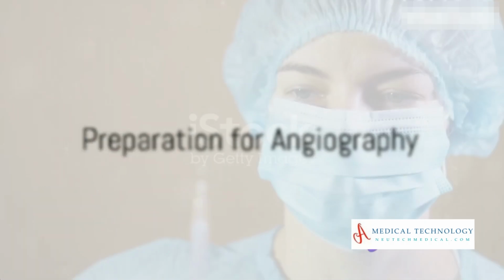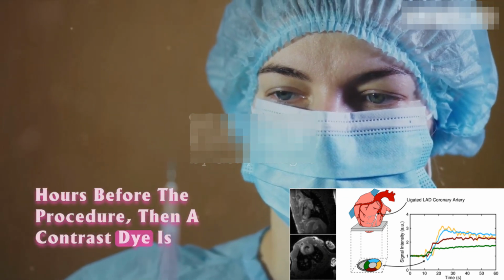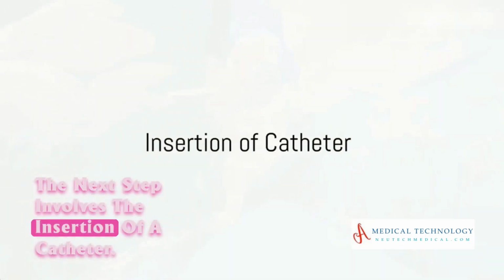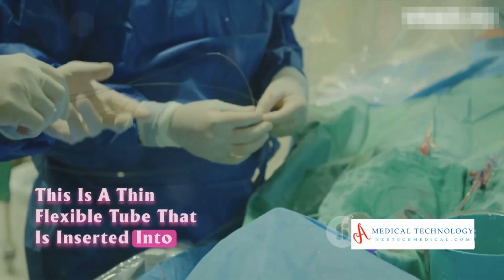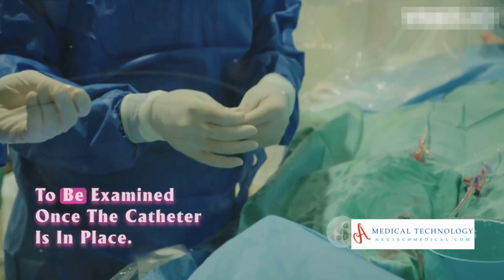The process begins with preparation. The patient usually needs to fast for a few hours before the procedure, then a contrast dye is prepared for injection into the blood vessels. The next step involves the insertion of a catheter. This is a thin, flexible tube that is inserted into a blood vessel, often in the groin or arm. It's carefully threaded through to the area that needs to be examined.